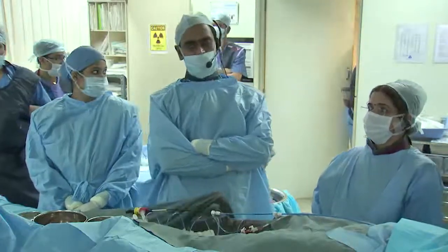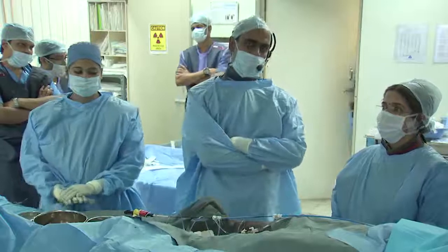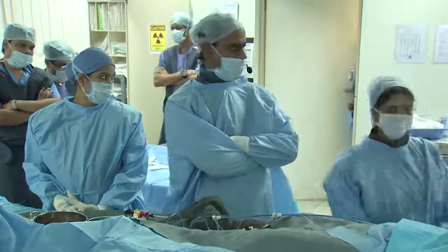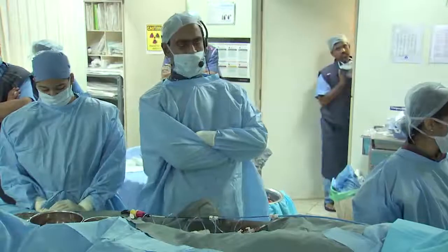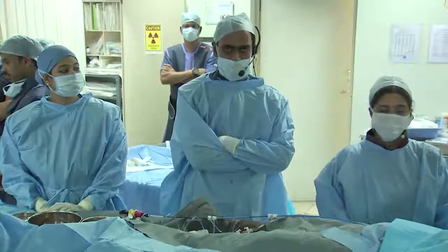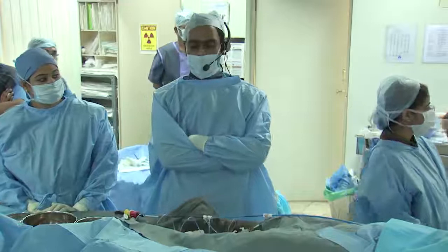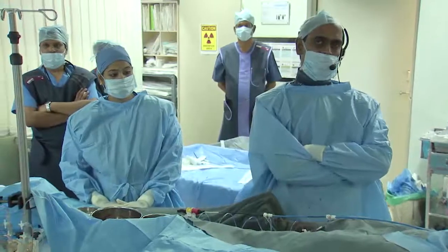6, the actual fenestration was measuring around 8. So 6 will probably make it a little smaller, but we wanted to have some fair amount of increase in the oxygen saturation. Right now, as I speak to you, the child is not on any supplemental oxygen. The saturations are 83%. It has marginally increased by about 5% compared to the pre-procedural, like at the beginning of the procedure. The Fontan pressures are not substantially elevated. It continues to remain at the same 13.